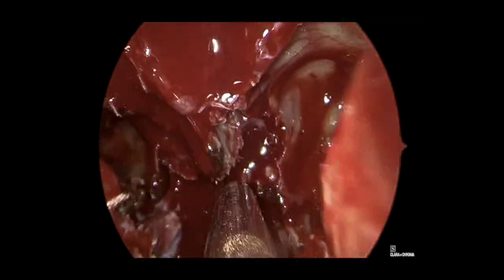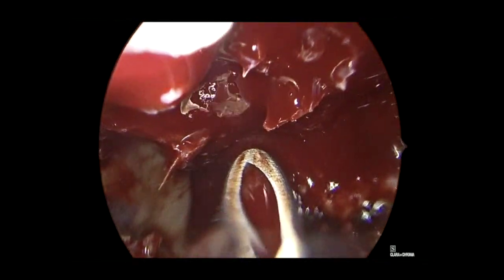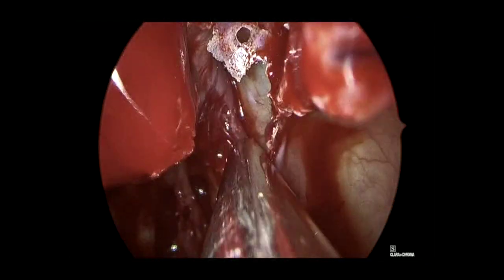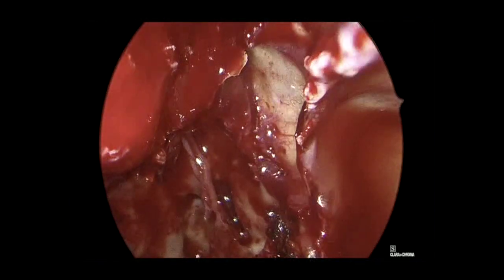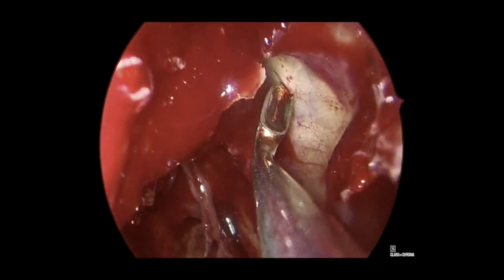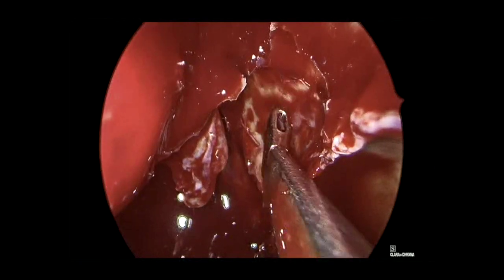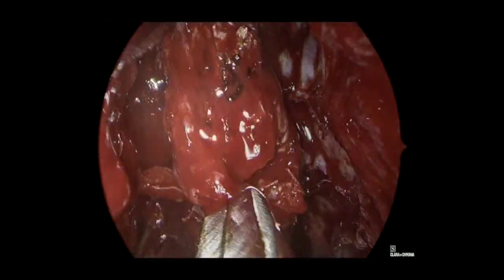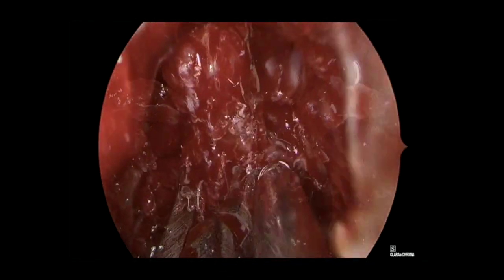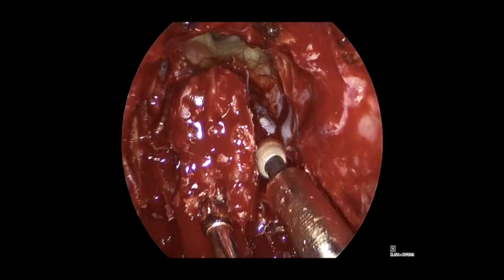Typically at this point, we'll debulk some of the tumor as my neurosurgical partners get ready to come into the field to complete their osteotomies, just to get a little easier access and wide exposure bilaterally. Although the mucosa appears normal in the ethmoid cavity along the orbits, we will obtain some sampling margins there to be definitive — and these were negative for tumor. Now we'll debulk the central tumor along the middle turbinate attachment points in the olfactory cleft, clearing this to get better access to the bilateral cranial base.